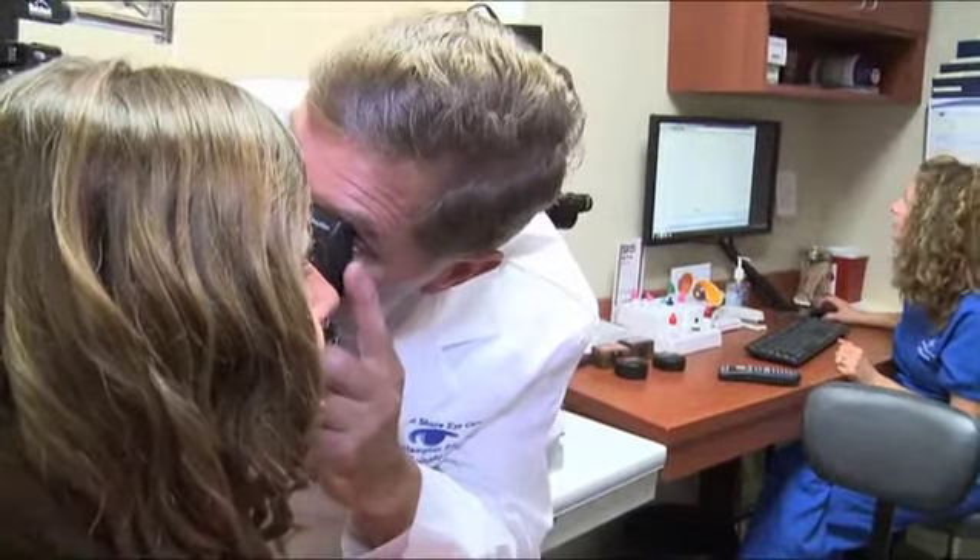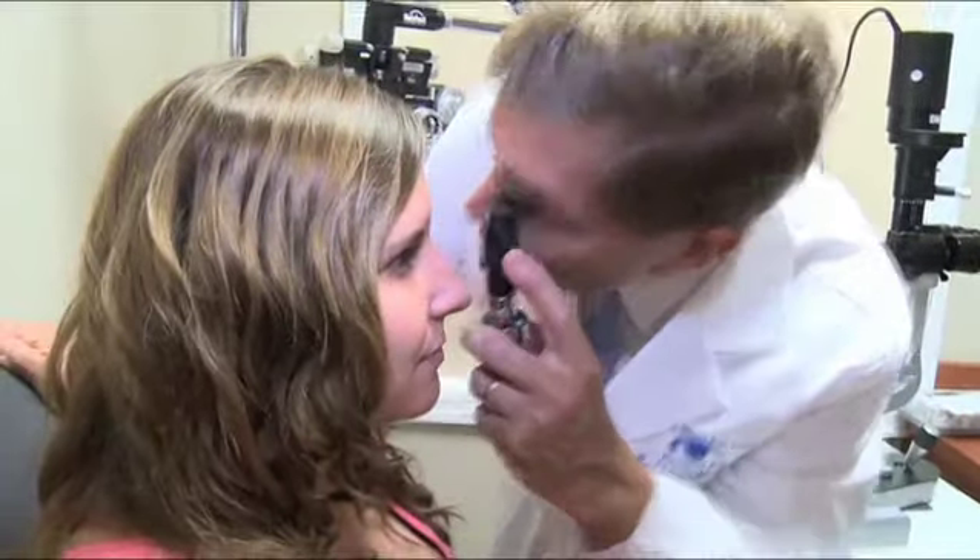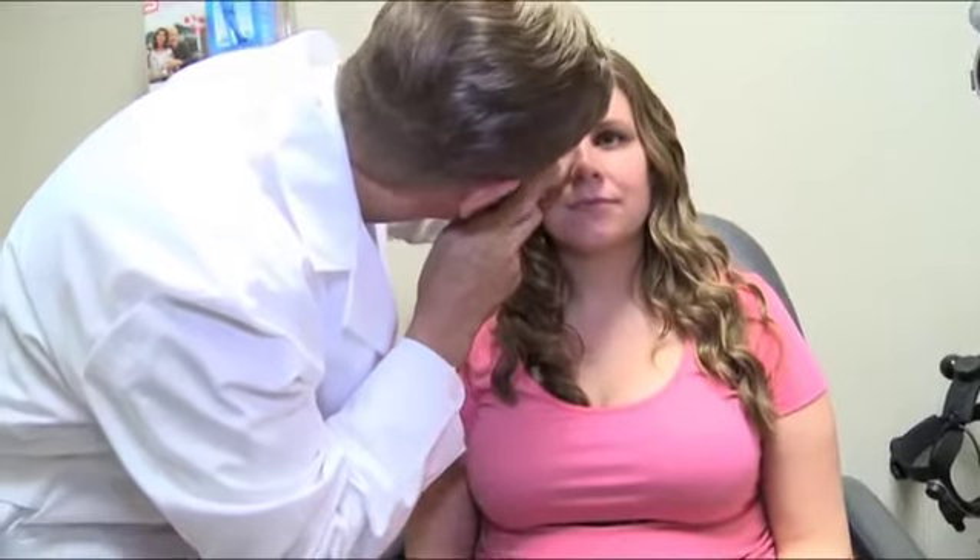When they first arrive at the hospital or the ambulatory surgery center, they're prepped for surgery — their eyes are cleaned and they're given dilating drops to dilate the pupil. They're then brought into the operating room, where a little bit of sedation is given just to relax the patient and take the edge off. At that point, the nurses are getting all the instruments ready, the microscope is focused, and then the surgical procedure begins.